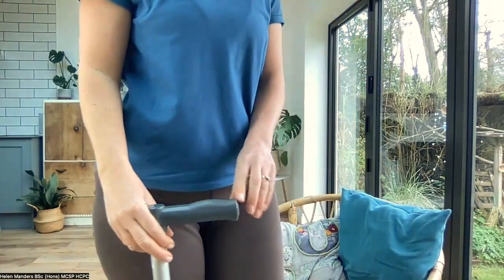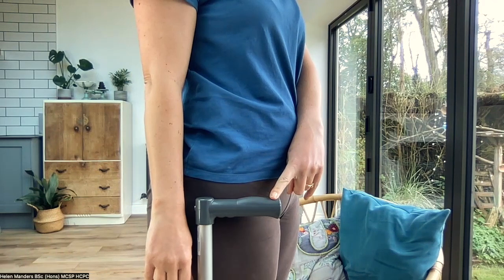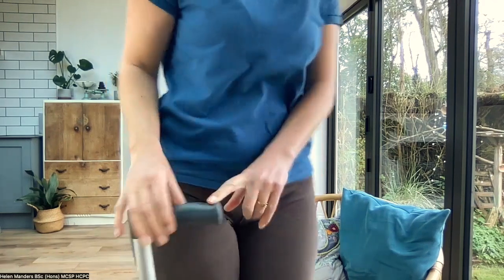And the best way to measure this is if you find your knobbly bony bits on the outside of your wrist there, okay? And when your arm is relaxed down by your side, that wants to be in line with the top of the stick. So let me show you. This stick's the right height for me. So with my arm relaxed, that knobbly bony bit that you can see there is at the top of the stick. Now everyone's different, so if you get it to that height and it just feels like it needs to be a tiny bit higher or a little bit lower, that's absolutely fine, but that's a really good place to start.